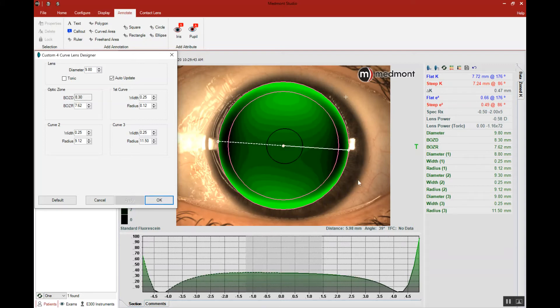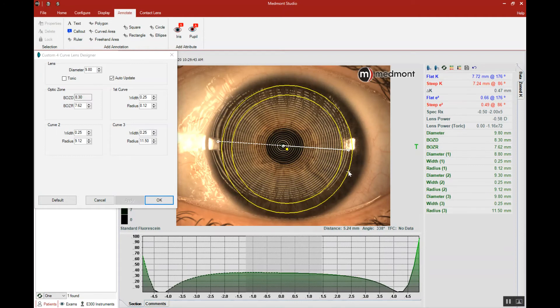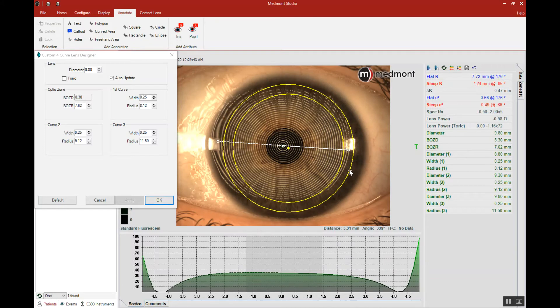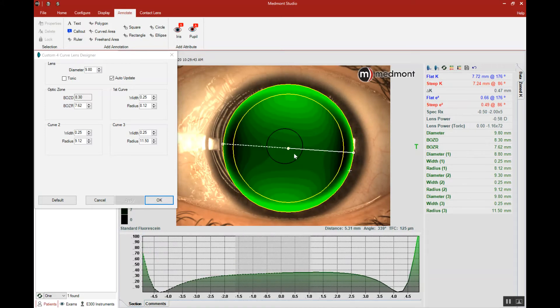Then we could pick up the contact lens and place it where we think it looks centered on the visible iris the way we would like to see it through the slit lamp. Then we click our cursor in the center and determine the apical clearance.